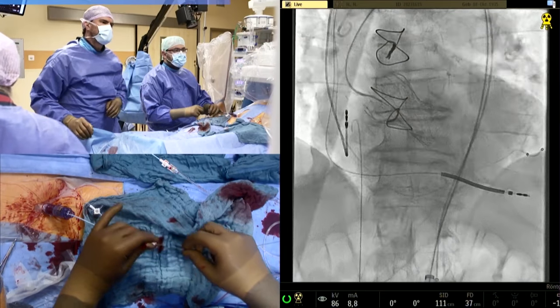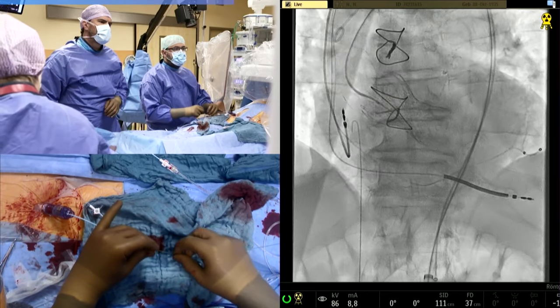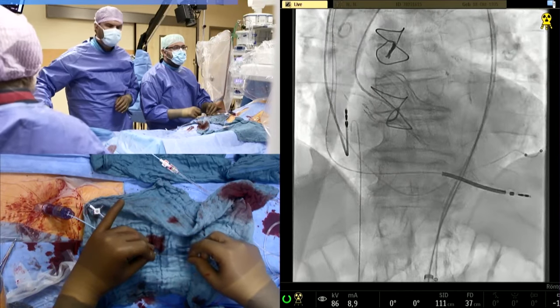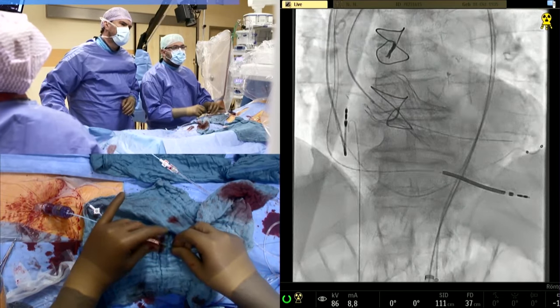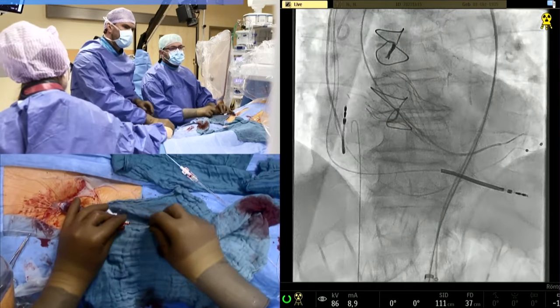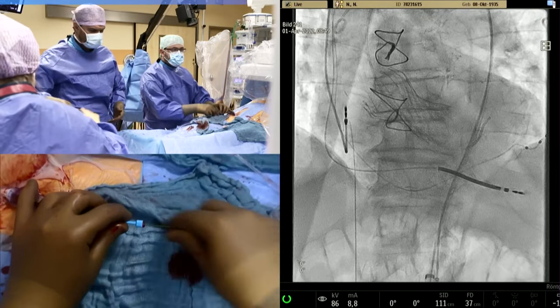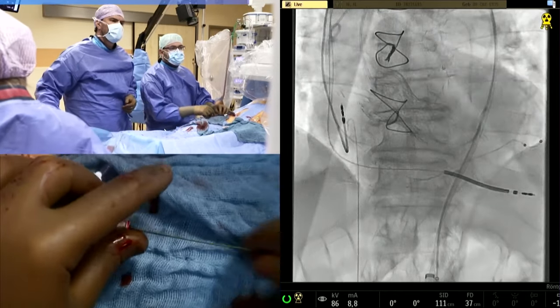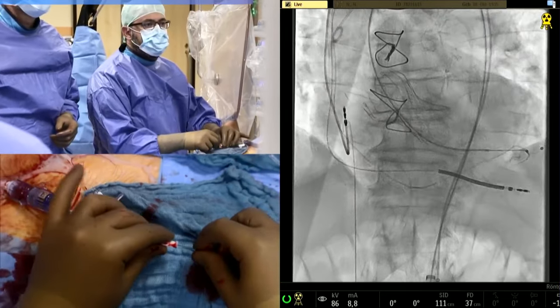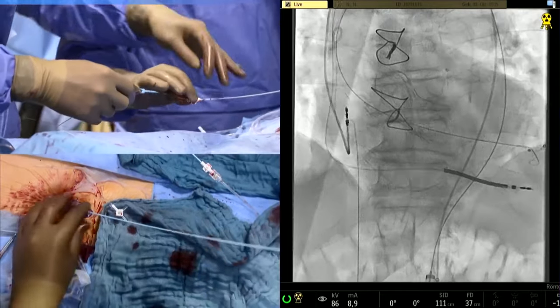Okay, so you need to be careful, and you need to be sure that you're crossing really through the valve leaflets and that you're not entangled in any one of these stent struts. And this is why it will be important to judge your crossing in two different views, and also to make sure that the catheter is crossing without any resistance. What you've seen here, that we advanced the catheter without any resistance, which again speaks for the fact that we are intravalvular and we're not stuck somewhere between the stent struts. I mean, you can, of course, theoretically get out and get in again, but to tell you the truth, it doesn't feel like that.